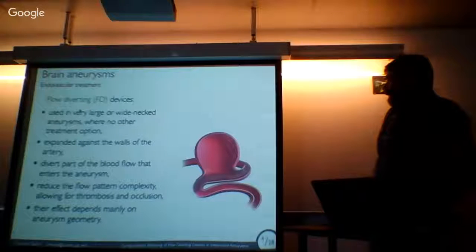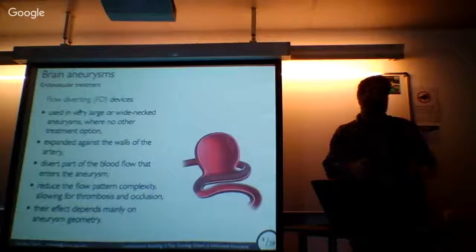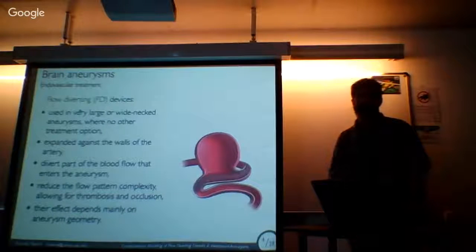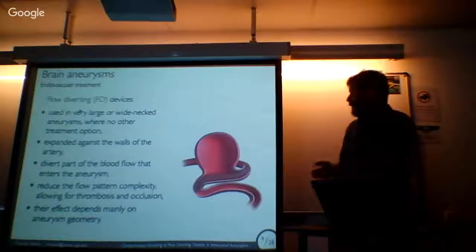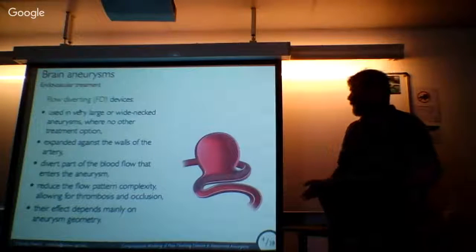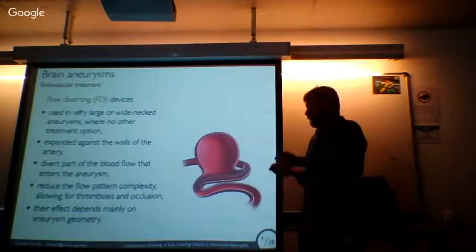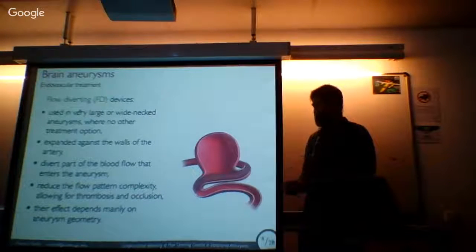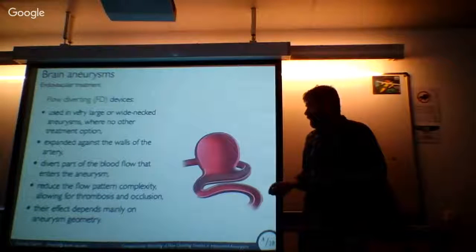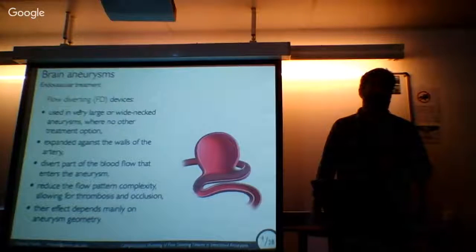Okay, the thing is, we have the doctors that decide that the patient needs a stent. Now, the next question is, which stent are we going to use? And the answer is unclear, because it's not easy to guess, and mainly the effect is going to depend on the specific geometry of the aneurysm.